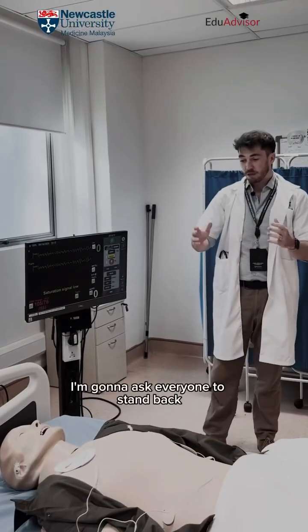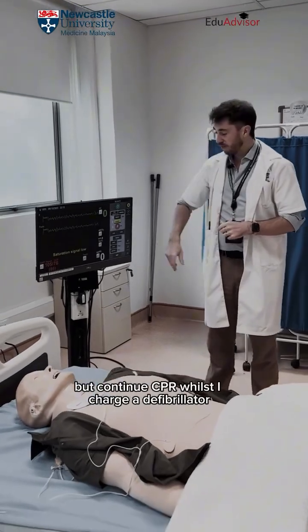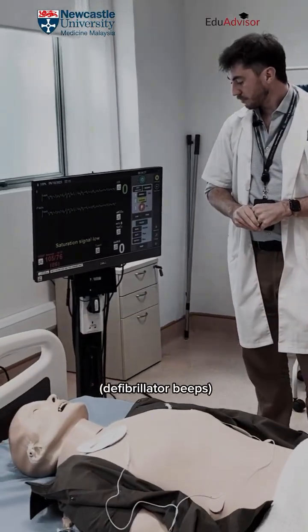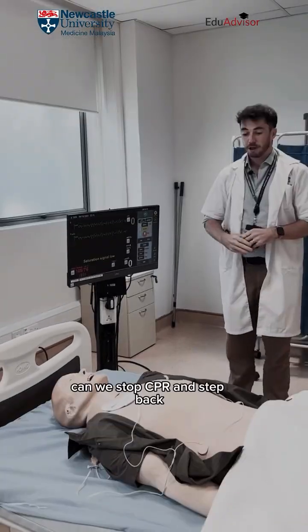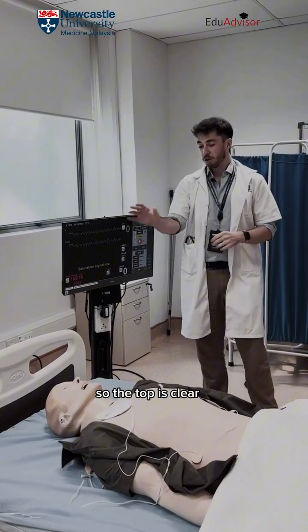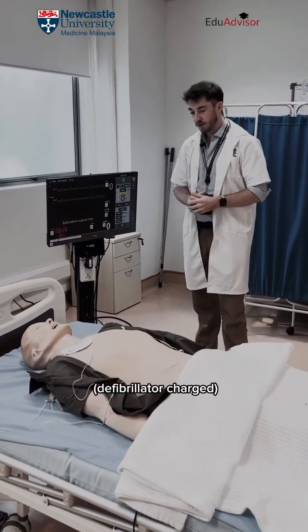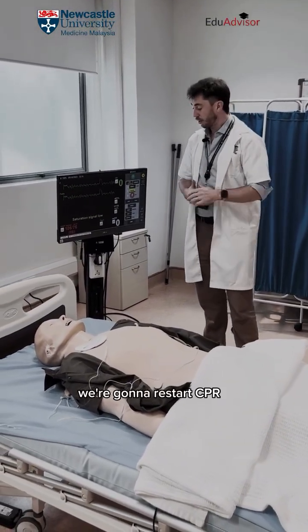I'm going to ask everyone to stand back but continue CPR whilst I charge the defibrillator. Can we stop CPR and step back? The top is clear, the middle is clear, the bottom is clear. We're going to deliver a shock. Shock delivered. We're going to restart CPR.